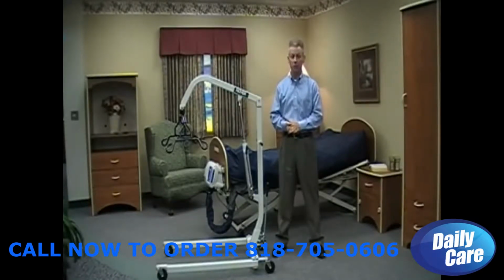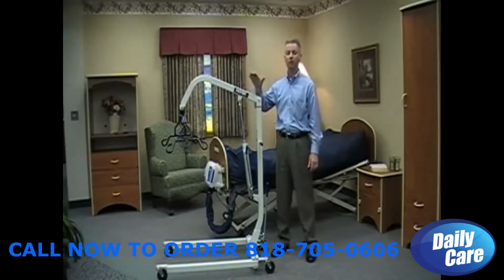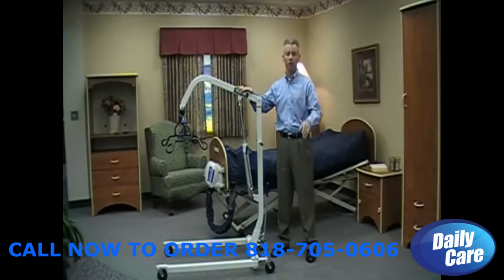I'm going to spend a few minutes with you discussing the Hoyer HML400. The HML400 is a hydraulic patient lift capable of lifting 400 pounds, so up to and including a 400-pound resident. In addition to the video that you're going to watch, we recommend that you review the user manual, operator's manual as well, so that you have a full working understanding of how the HML400 operates.